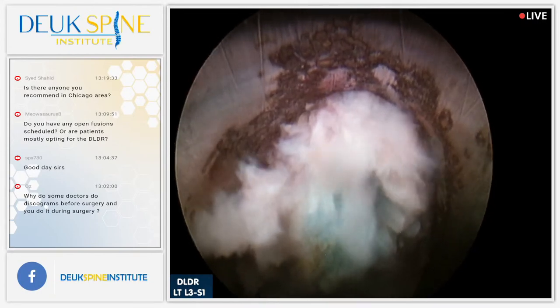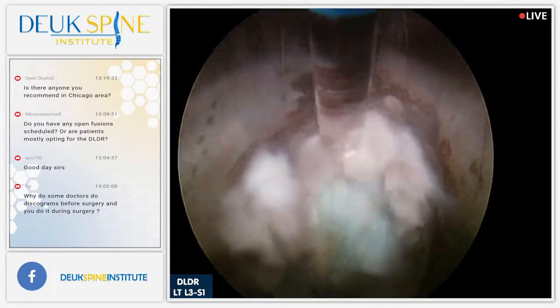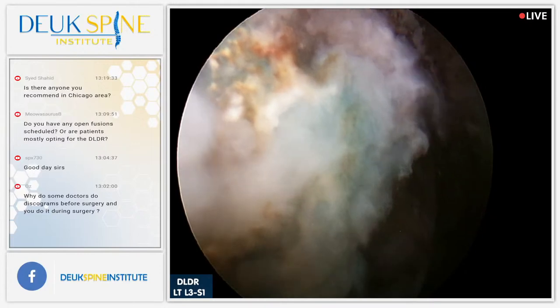I took photos, but in my opinion, out of everything, I think the ones we have are better? In my opinion, yeah. This one doesn't suffice. There's a piece of herniation right there, by the way. Just so you know, I'm going to try to grab it out.